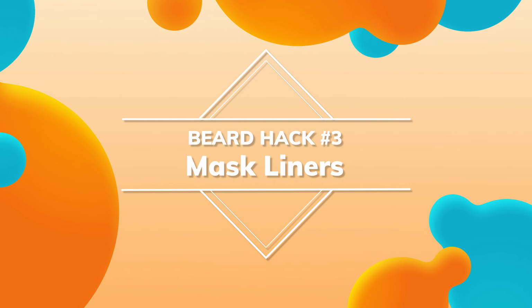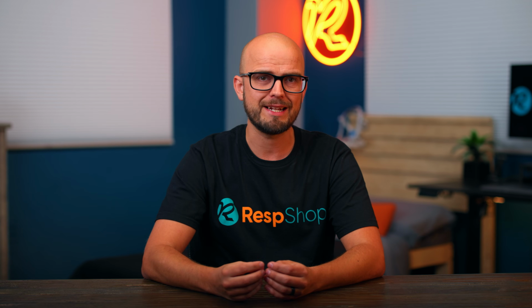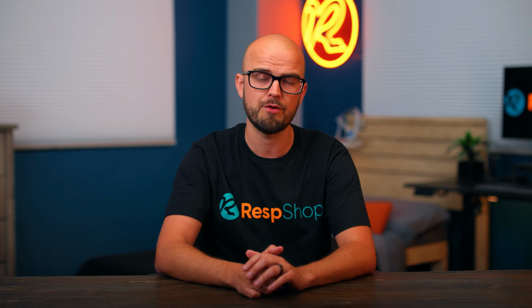Hack 3. Some people find mask liners can help improve the seal with facial hair. The liner fabric seems to be more forgiving of the bumpiness that comes with facial hair, so give this a try if you're having problems.